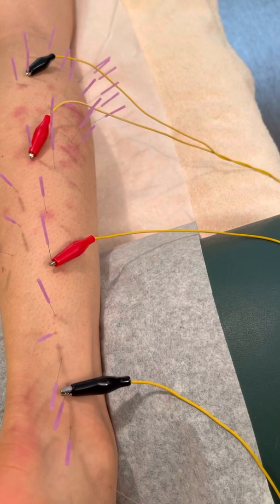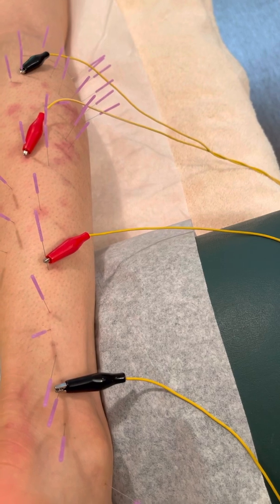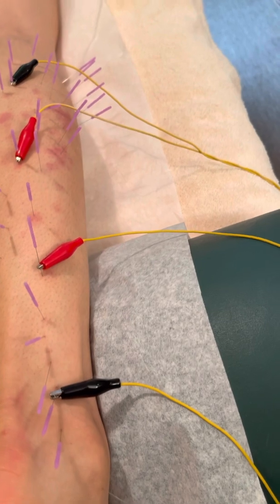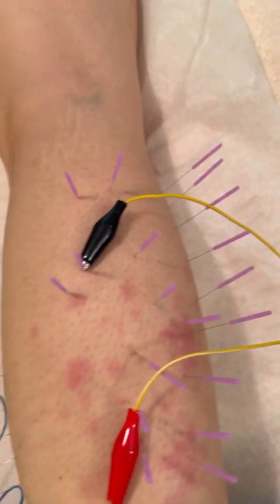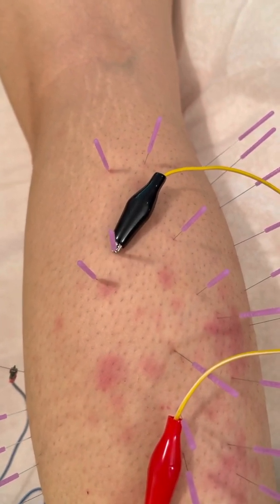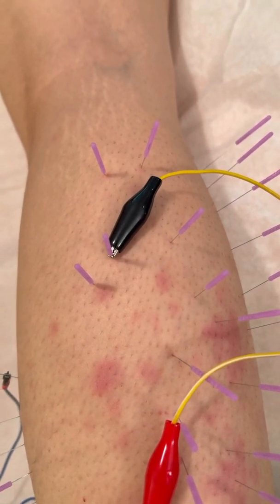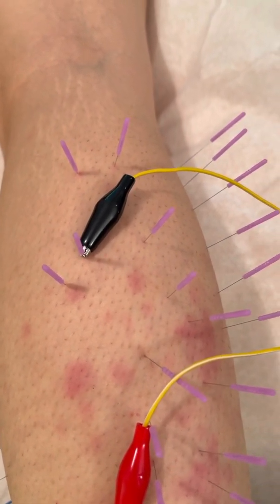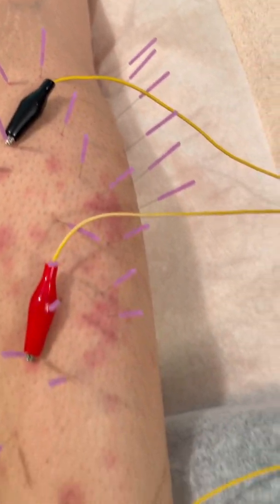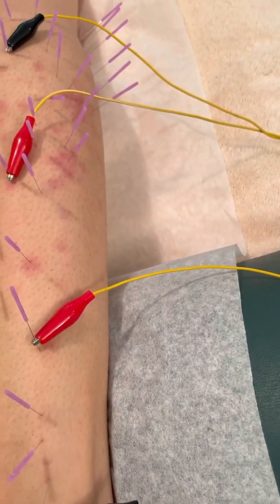Maybe a little bit stronger, actually. Okay, let me turn the inside one up a little bit and the other yellow one up a little bit. Oh, is that too much? No, that's good. Okay, so you can really see here, that's the zzz part. And now it's going dot, dot, zzz, and then there, it's still going. And so when the electrode stops, that means her muscle is contracting even more. And so you get the muscle to contract and then it releases.